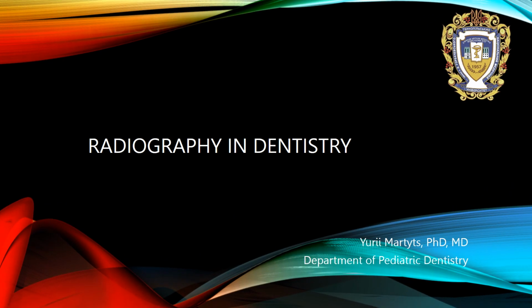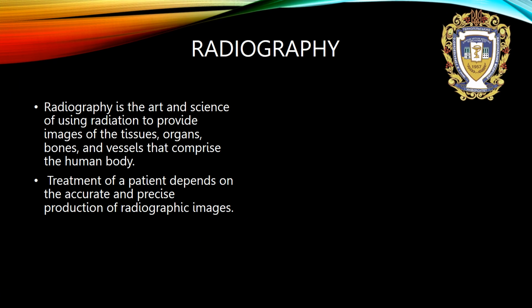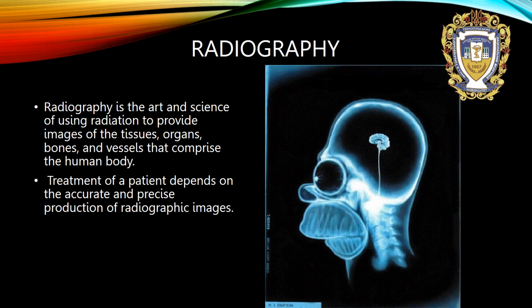Radiography in dentistry. Radiography is the art and science of using radiation to provide images of the tissues, organs, bones, and vessels that comprise the human body.